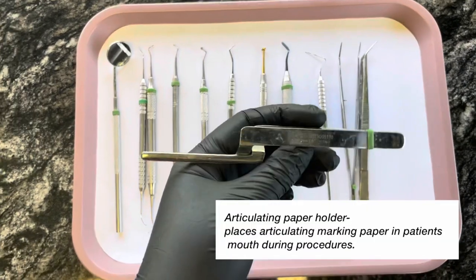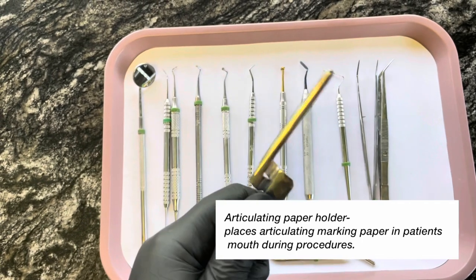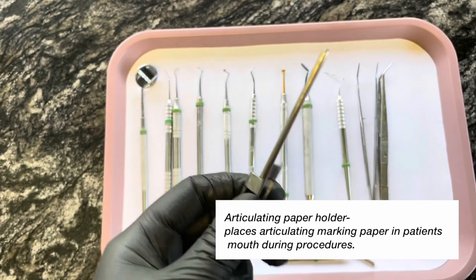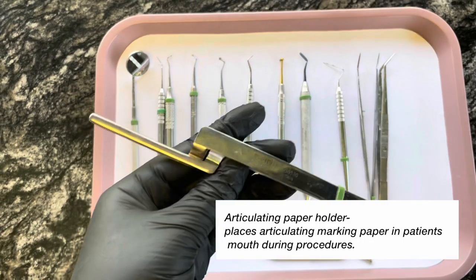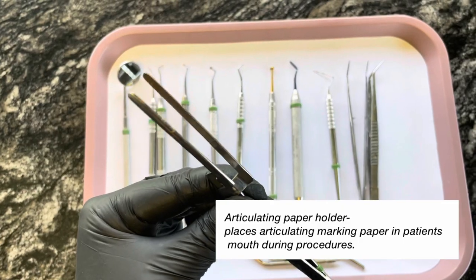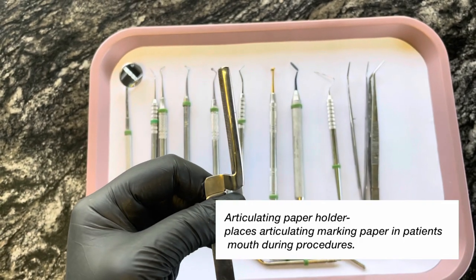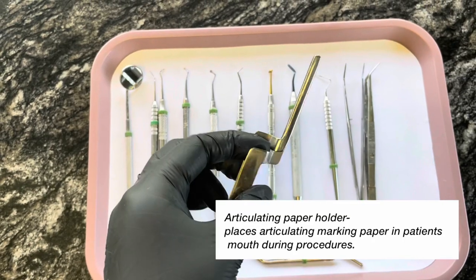Next I have an articulating paper holder. This is used to hold the articulating paper, and articulating paper is used to do bite adjustments. You just squeeze both sides to open it and slide your paper on the end, and it holds your articulating paper.